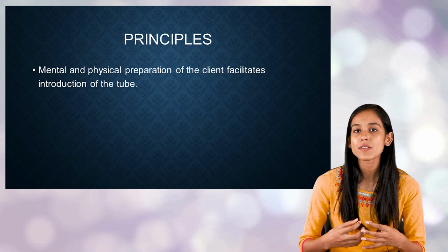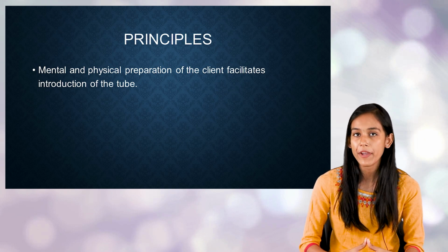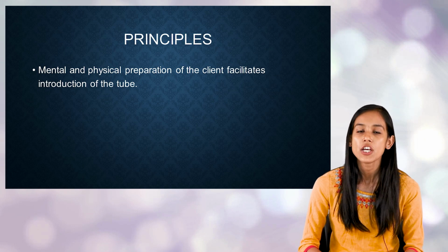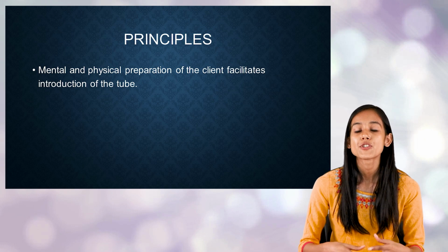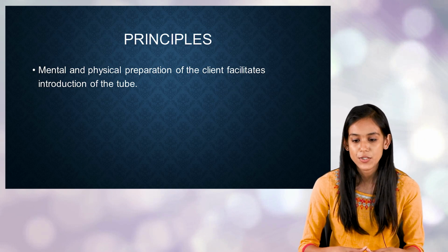So the client would resist every attempt you make, and if you don't prepare your client physically and mentally, it would become difficult for you to insert the tube properly. So preparing your client mentally and physically facilitates introduction of the tube.